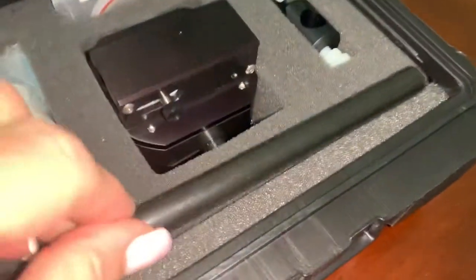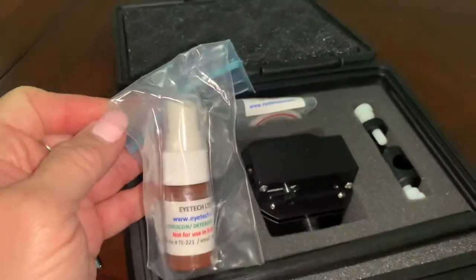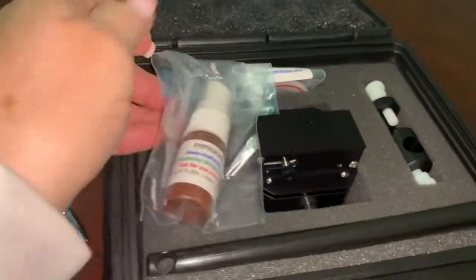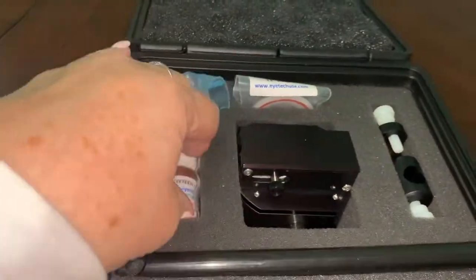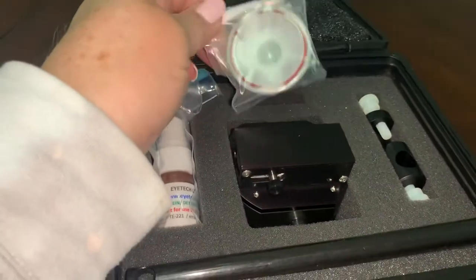Everything has a place in the container, which I really like. It comes with a fluorescein dye, which is not for human eyes. Replacements are available on their website as well. It's a spray for fake eyes.